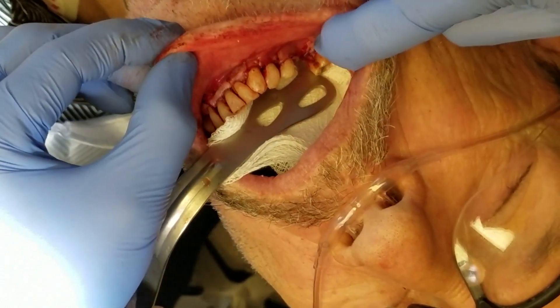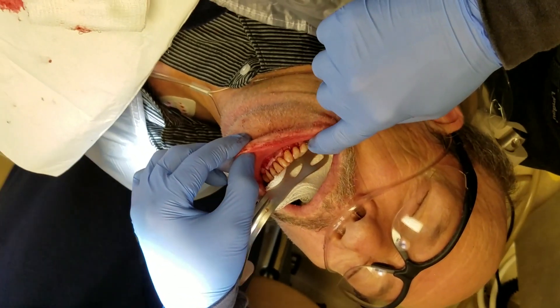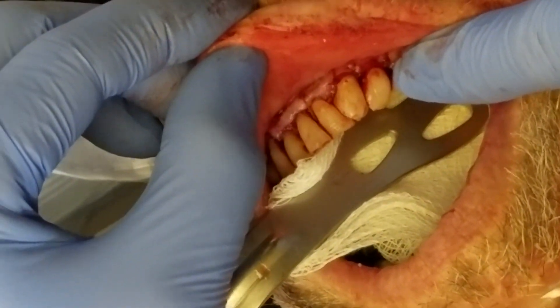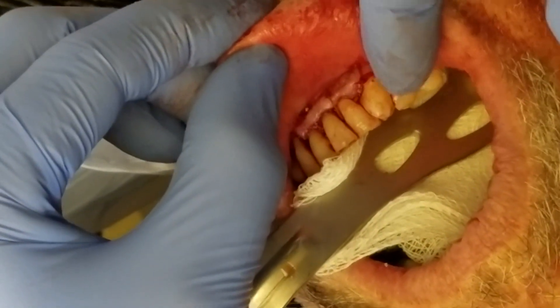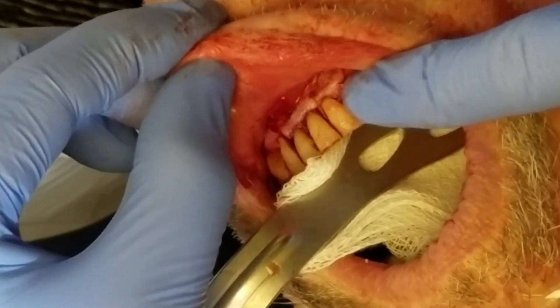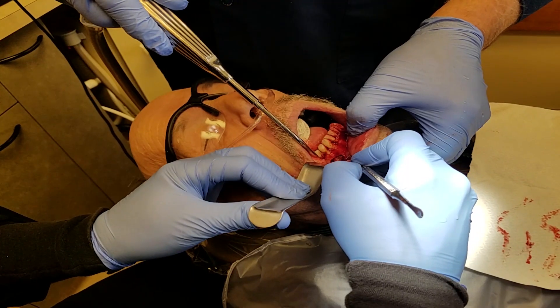We'll send that biopsy off. If it comes back as what I think it's going to — a keratocystic odontogenic tumor — we're going to have to take out tooth numbers 27, 28, and 29, because the cyst and any daughter cysts and tissue may be between these teeth. Given how large it is, to minimize the rate of recurrence we need to get those teeth out if it is indeed a KOT. The procedure went well, got the tooth out, enucleated the cyst, it goes in formalin in a specimen container, and then it gets sent to the pathologist who will give us a final diagnosis.